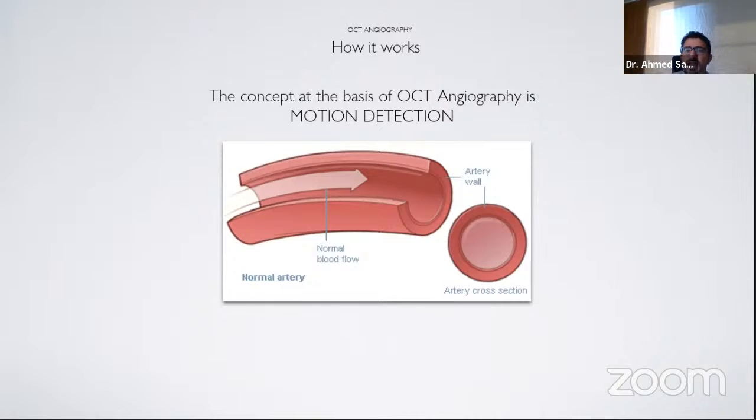So basically what is happening is that the system is capturing 2 consecutive images with nearly fractions of a second difference in time between them. And the system is mapping or tracking only the moving parts in this image. So what is moving in an image of a retina is the blood. By this technology, we are able to have a visualization of the blood vessels, like the FA, through mapping the moving blood.